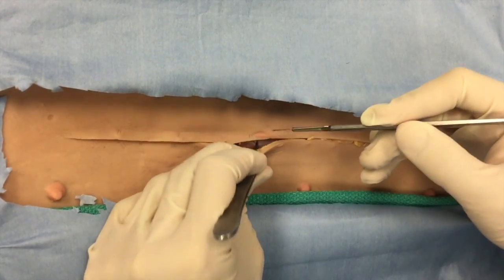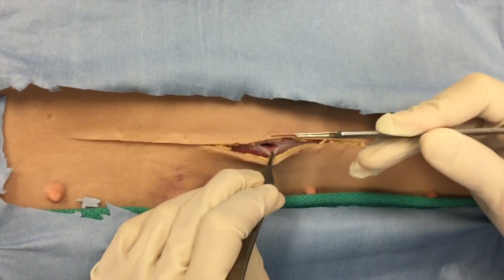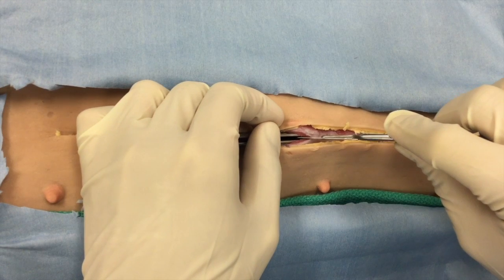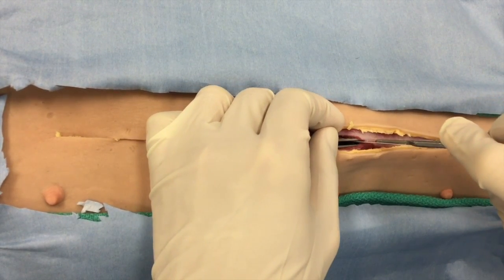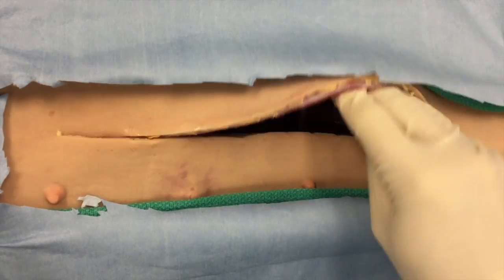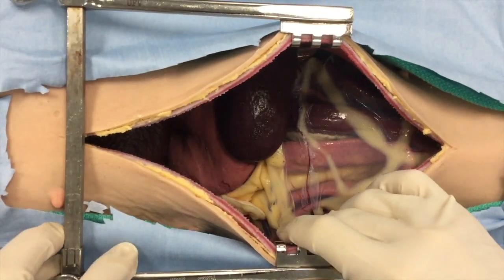We'll grab the linea alba with some forceps, tent it up towards you with the blade facing up, and make a stab incision right at the level of the thumb forceps. We'll then slide thumb forceps into the abdominal cavity and then extend the incision through the linea alba with a 15 blade while tenting the linea up towards you.